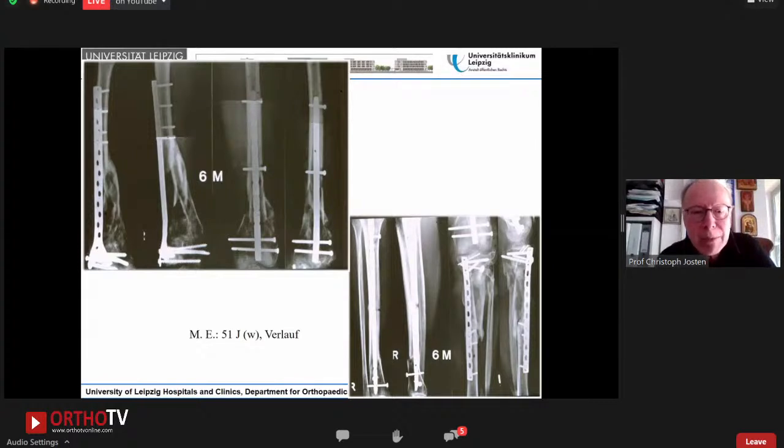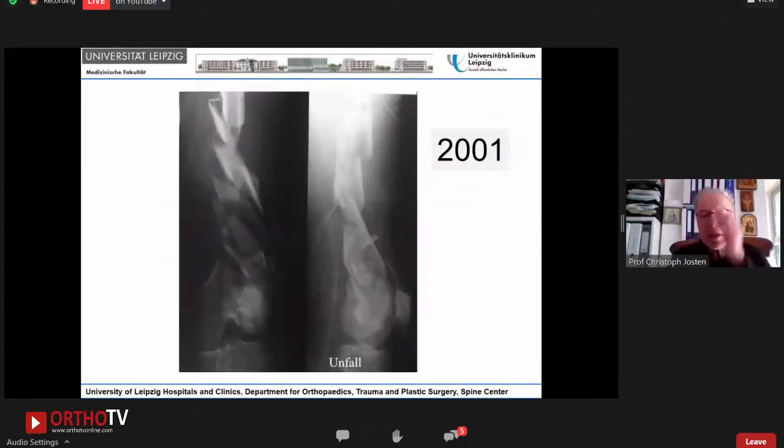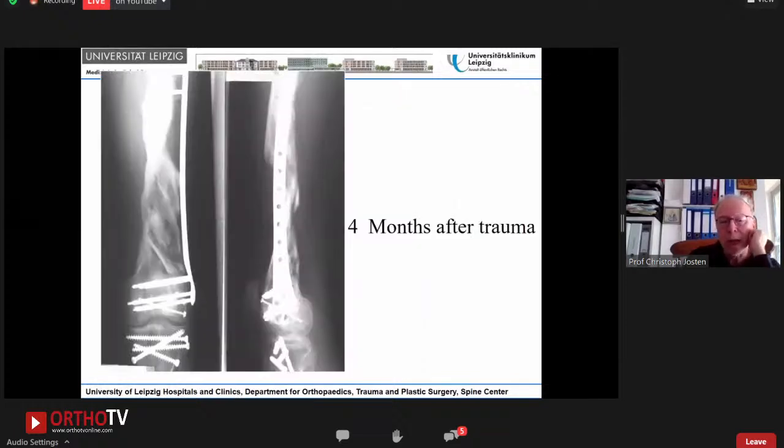Simple implants. We didn't make any medial support. And this is the clinical picture of the lady, of course. It's a good result. This is 10 years later. This is also a smashed distal femur fracture. And also this was one of the first angle stable plates in the classical philosophy. Christian Krettek showed it to you. Maybe that there is some recurvation of the distal femur, but nevertheless, we had 4 months later a good and sound healing.